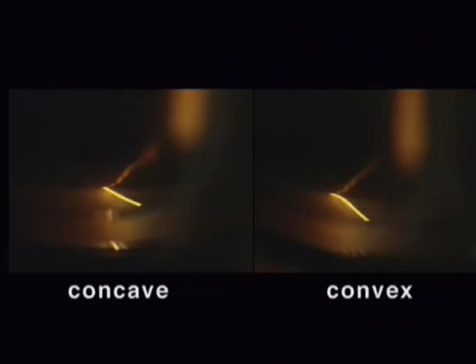Here the artifact is obvious due to the conspicuous corneal folds. But here the deformation is detectable only by comparing the normal corneal curvature with the slightly unnatural curve of the cornea. Just compare the normal concave curve and the abnormal slightly convex curve side by side.